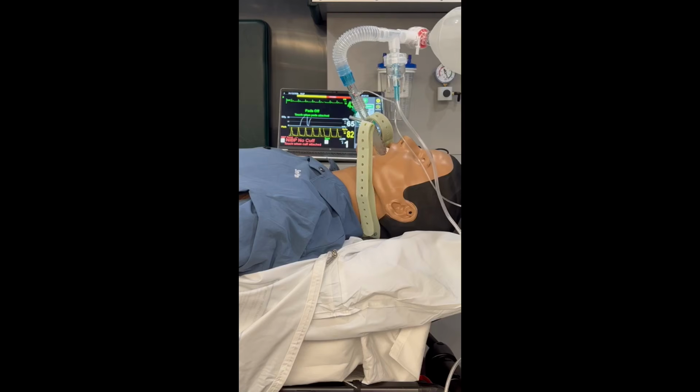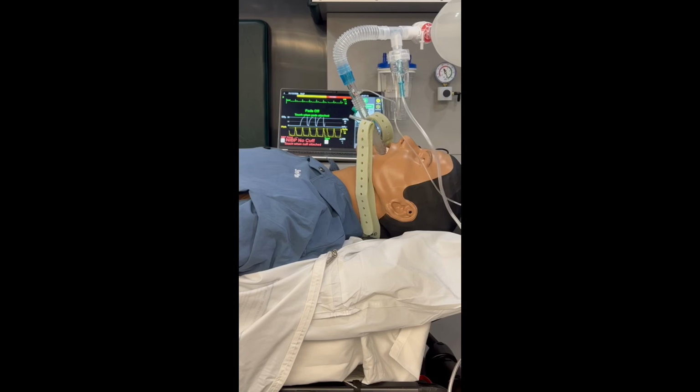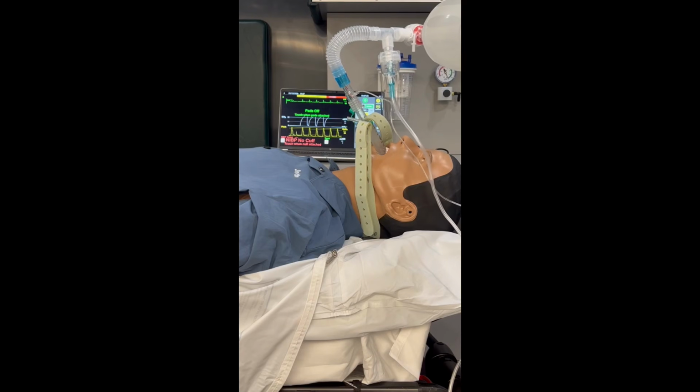Something else that should be considered is the amount of oxygen sources required. Ideally, you should have two oxygen sources, one for the bag valve mask and one for the nebulizer. However, only one oxygen source may be available on scene, at which point you need to attach that to the nebulizer to achieve the desired effect of nebulizing the medication and then using the bag valve mask to provide the assisted ventilations to administer the medication.